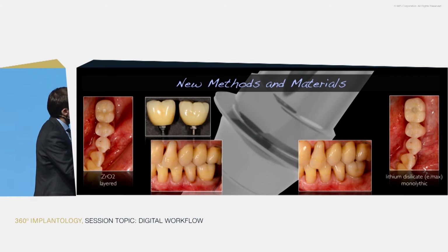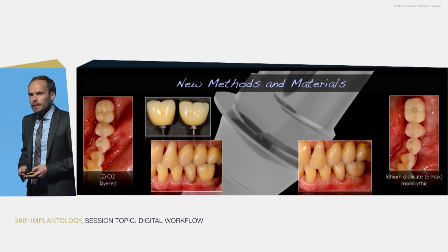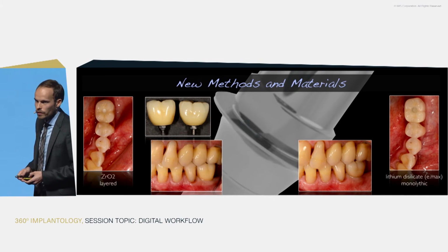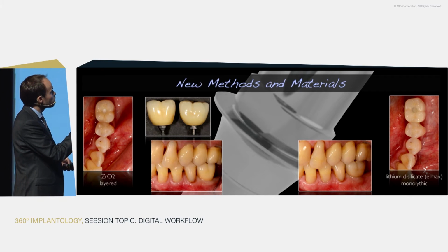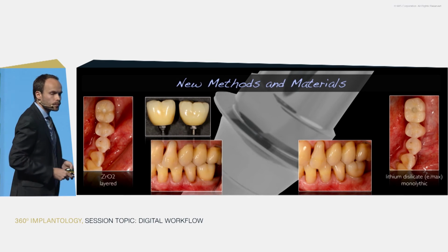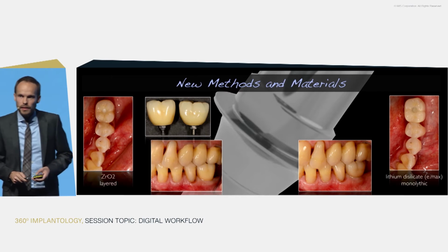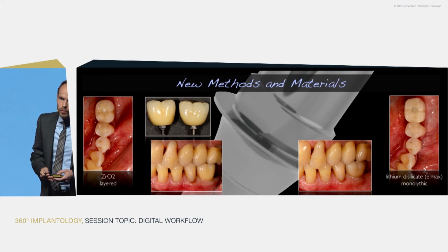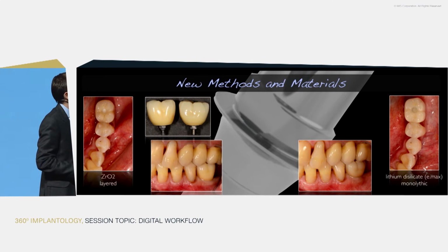And this case really made me change my mind. It was a case that we did back in Zurich, I think 6 or 7 years ago, and we had to redo it for the fact that we used the wrong titanium base. And what you see here is the zirconia layered crown, and on the other side you see the lithium disilicate crown, just stained and glazed. So we had to redo the crown, and we were not really happy about it. It was just a mistake that happened in the lab.